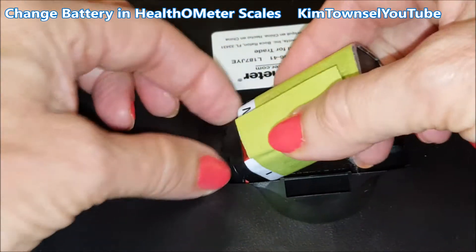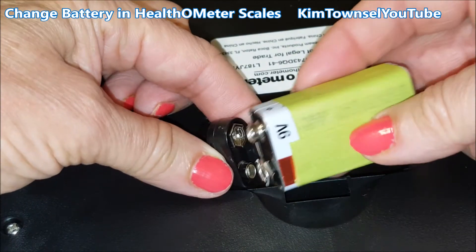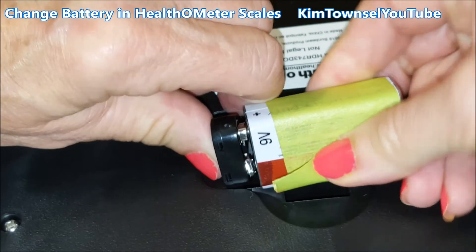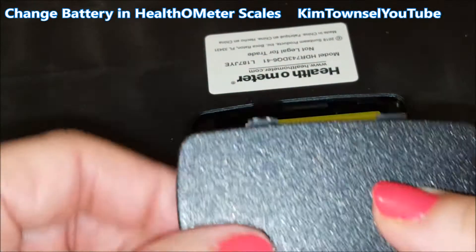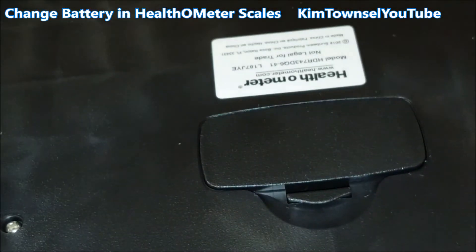It comes out and you just have to pull it off like that, then do the opposite — snaps in like that, drops in. Make sure you have the lips going in the holes and the clicker like that.